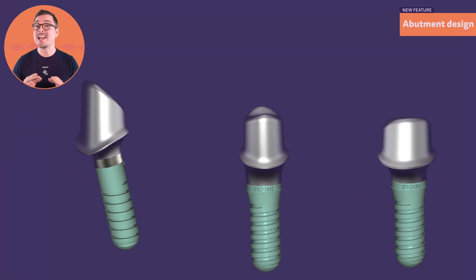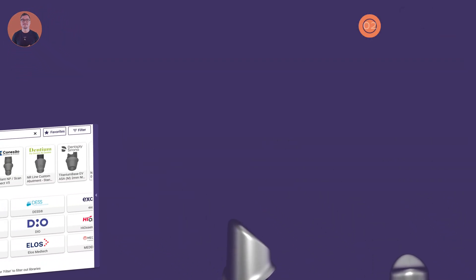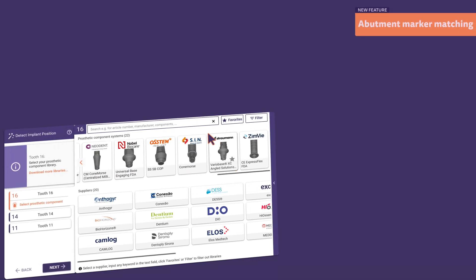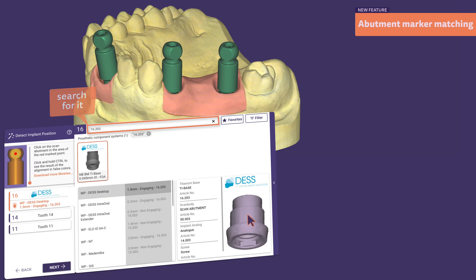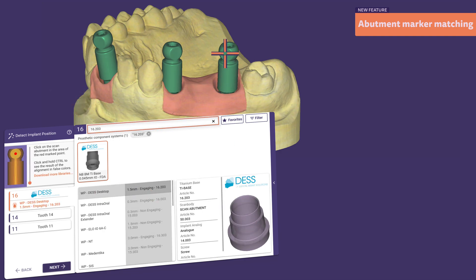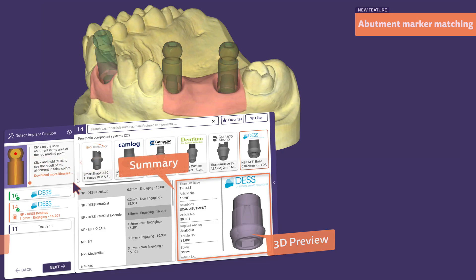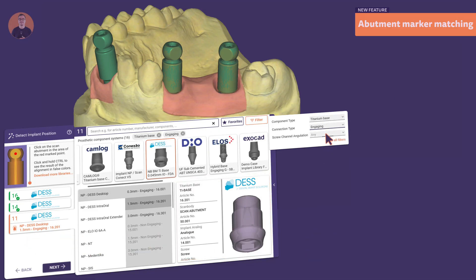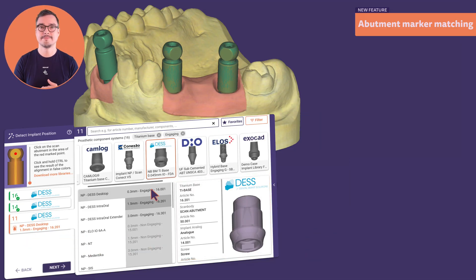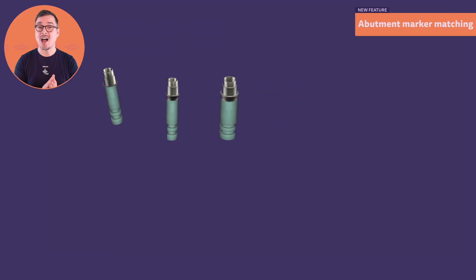Our implant library has been getting larger and larger to give you the maximum freedom of choice. Now we've made it easier to find the right library for your case with an all-new sleek implant dialog. Just start typing to quickly find the component you need. The 3D preview in the summary sheet helps confirm your selection at a glance, and you can filter by component, connection type, and angulation.